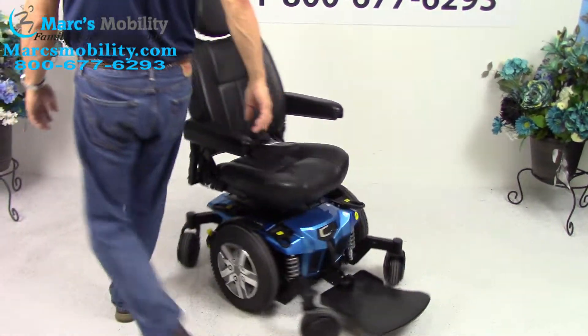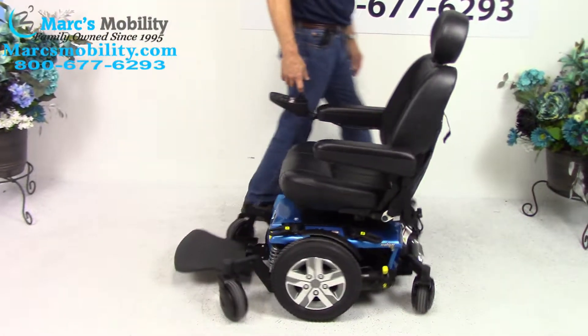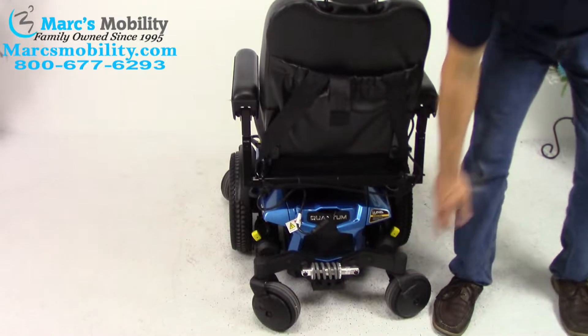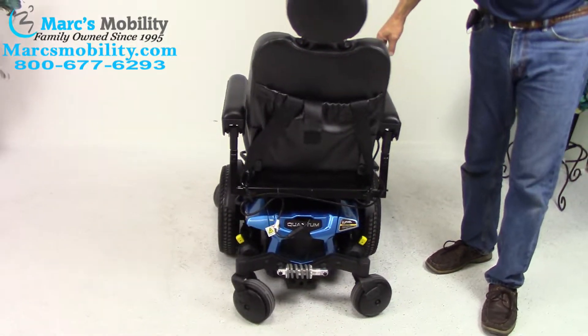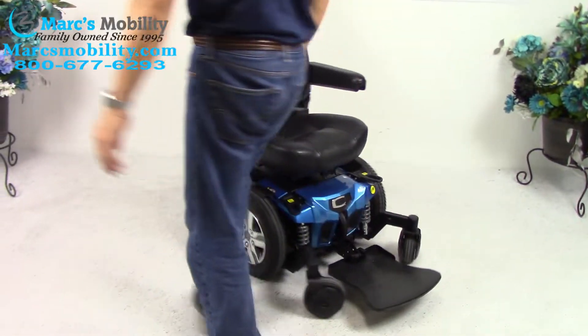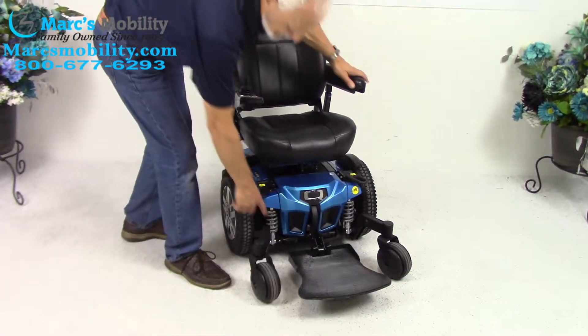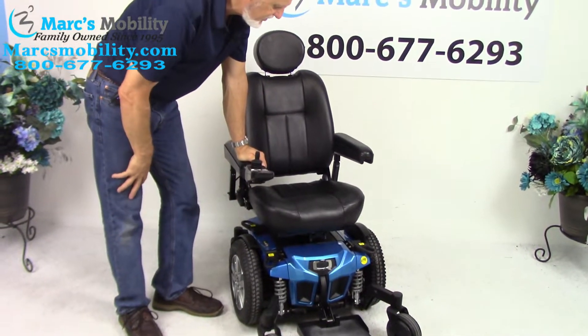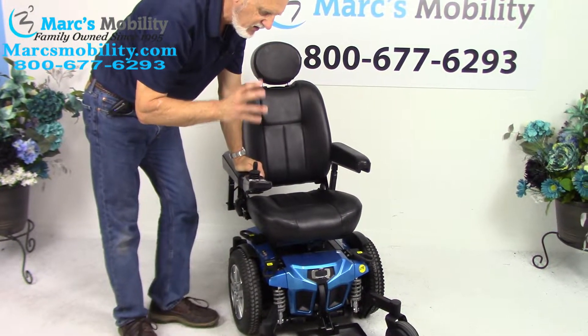I can't even hear this chair — this is so quiet. You can see the suspension in the back right here; it's adjustable. You can see the same famous suspension in front. This company is really famous for their suspension. You have three of these heavy duty suspension systems on this chair — just great suspension.